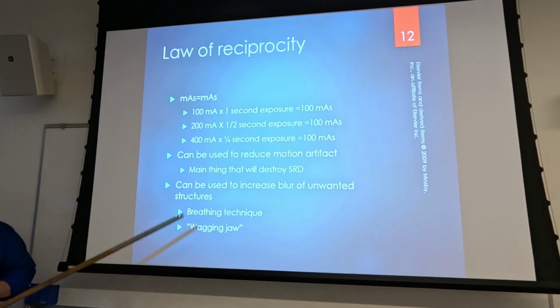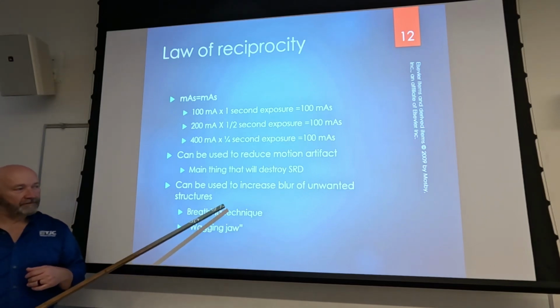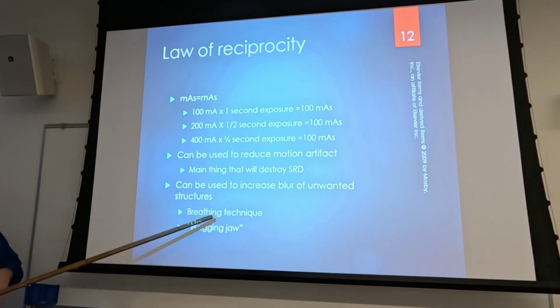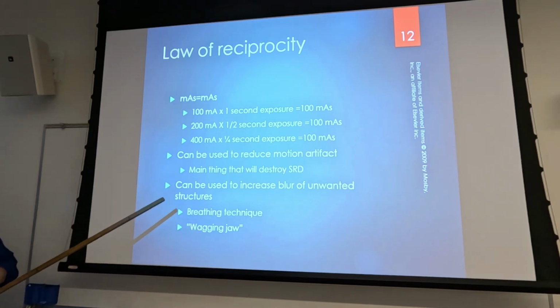So increase time, decrease mA, same mAs, using reciprocity to get to a breathing technique, or to reduce motion, increase mA, decrease time, reciprocity. Okay? Any questions? What you got?